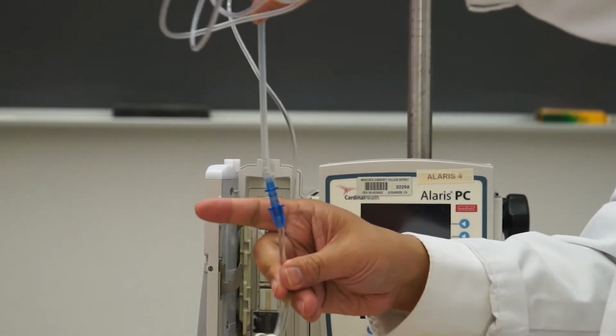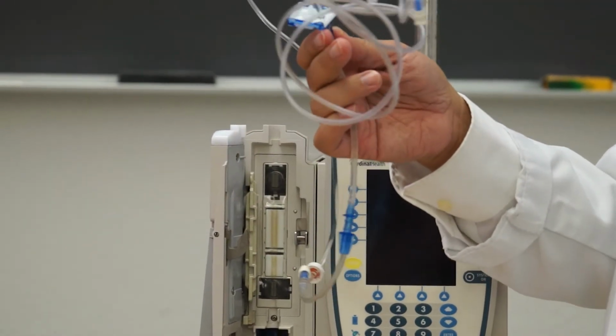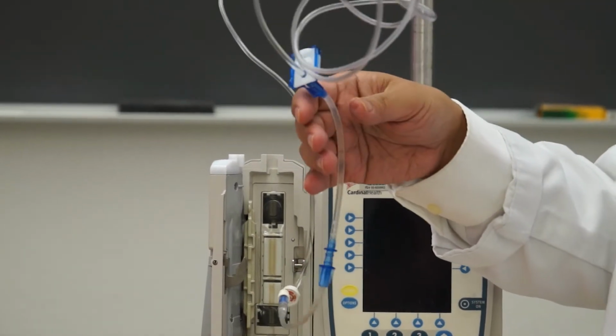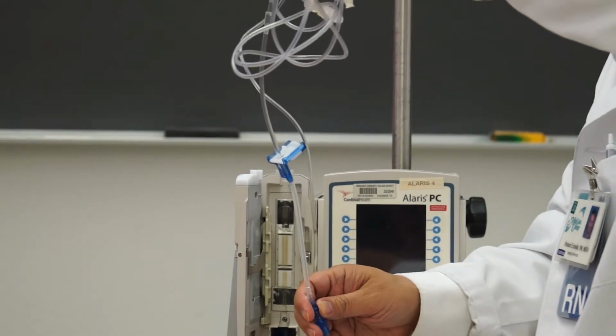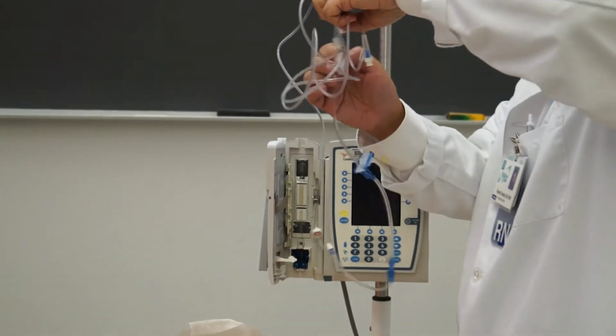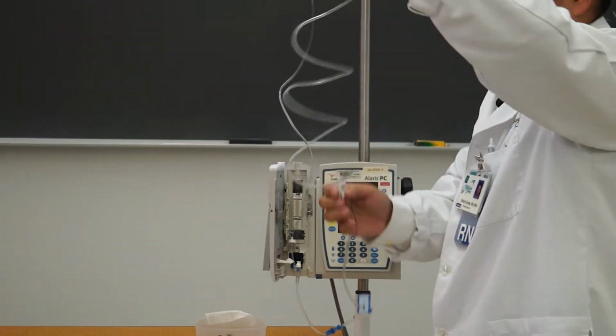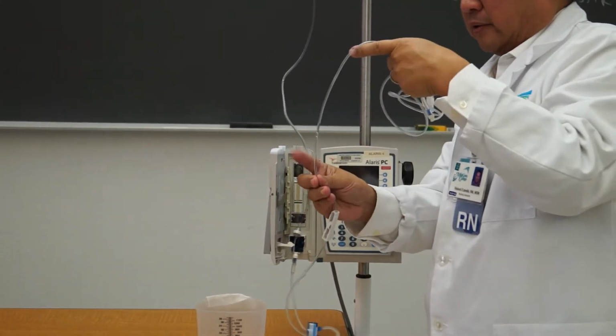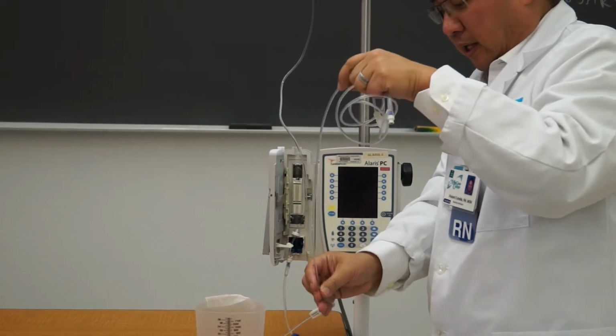It's like playing the guitar. Okay, I'm going to do this for just demo purposes. I'm moving the fluid. Okay, following the Y sites. See, there's air right there, near my hand right here. See, I'm following that. And it's not a race.